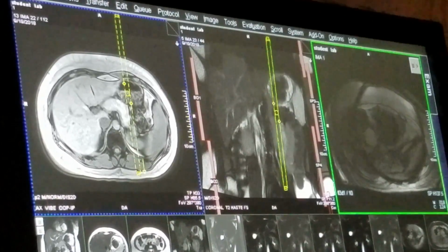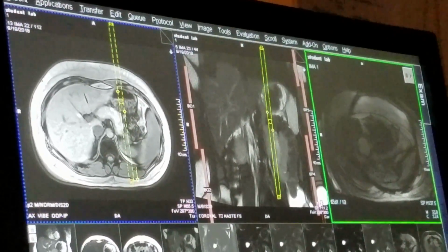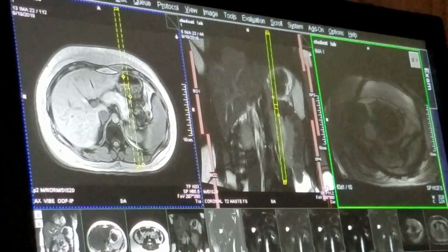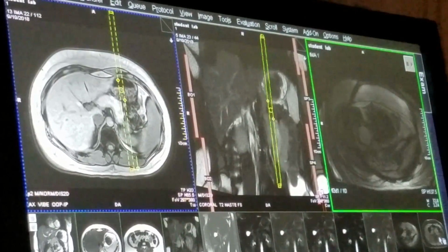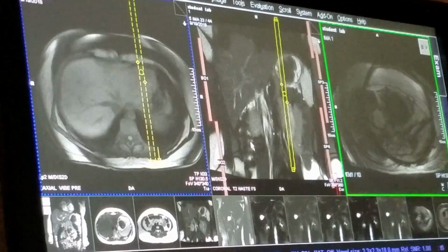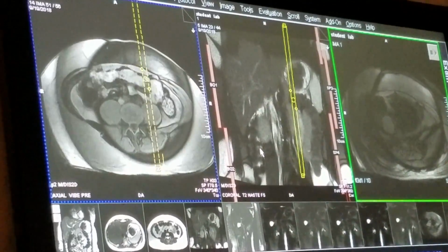If you select automatic, it's going to try to shim your adjust volume area when you're trying to inject the patient. So always pick manual. If you don't pick manual, you're going to miss your care bolus. So if I haven't said it yet, always pick manual. Okay. So our pre's just ran. We'll look at those. Checking obviously for motion. Make sure that it did in fact fat sat, because these are fat satted sequences. And check for coverage. So we're good.